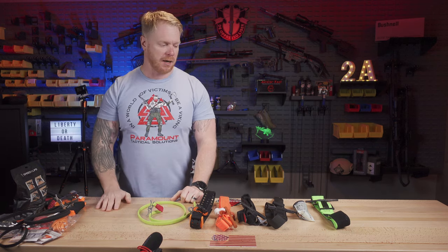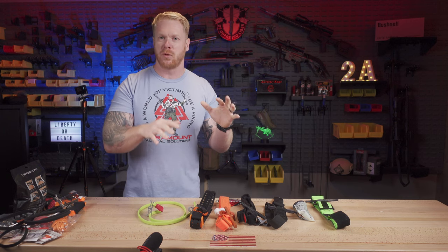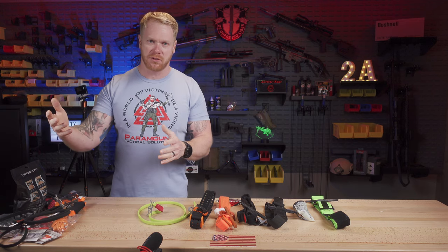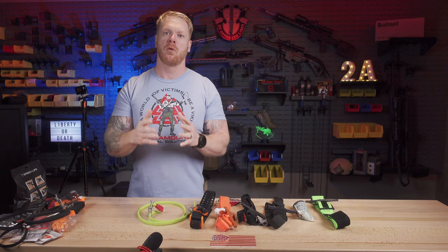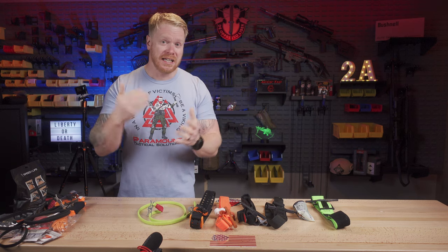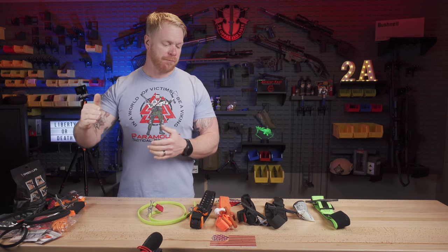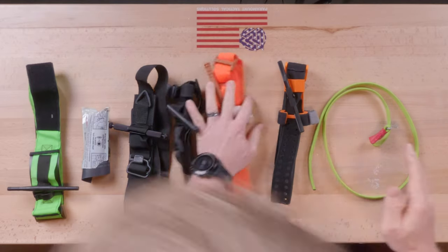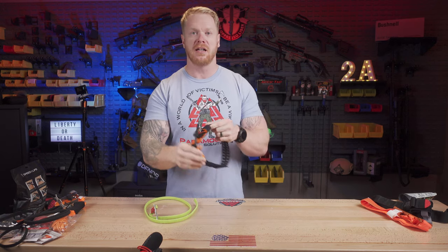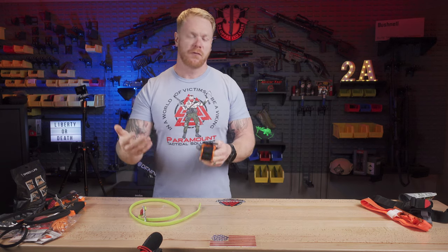There are a lot of different tourniquets out there, and it gets quite confusing. So these are the five or six tourniquets that we teach in our courses. We're a nationally certified NAEMT — National Association of Emergency Medical Technicians — training site. These tourniquets work, but what I wanted to do was use this video to boil it down to two tourniquets that are the easiest to use under stress and the easiest to get to and maintain a level of proficiency with.